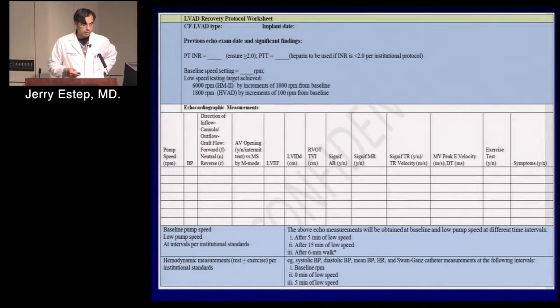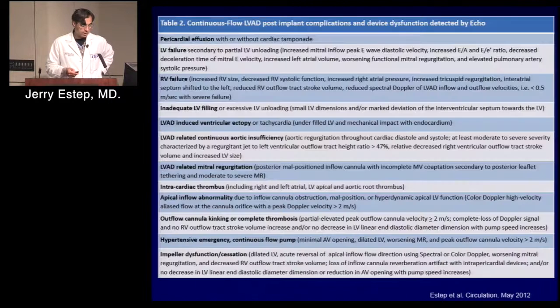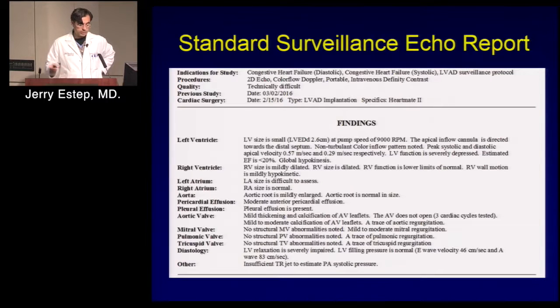And so this is supported by a document I had the opportunity to co-chair with Rain Steinbeck, which has everything related to echo and VADs. I think it's probably too long, but as a source document, you guys can look at it. And so there are clear working definitions for associated LVAD complications. Someone comes in with TIA or stroke, echo is still first line to understand clot, aortic root, LV in and around the inflow cannula and LV. CT is robust.